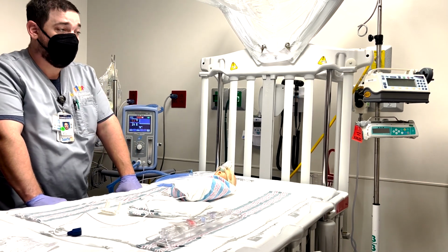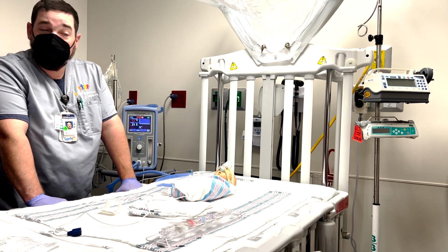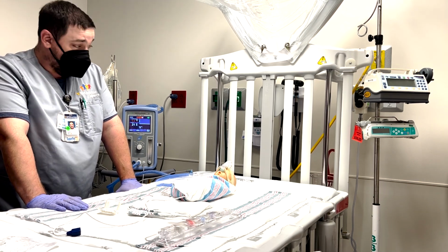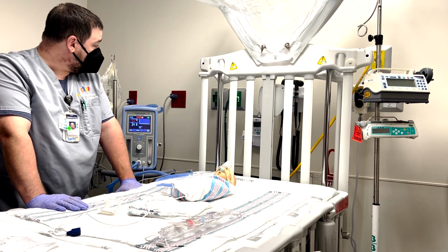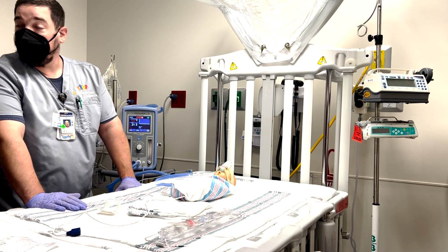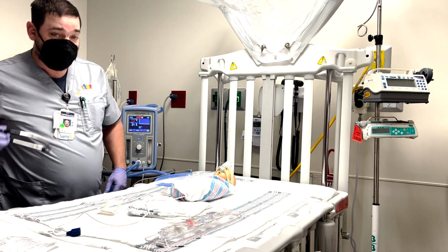So my numbers look good, not alarming. Better work of breathing, definitely. But the first thing I want to do whenever I have a good seal on the patient is listen to them.